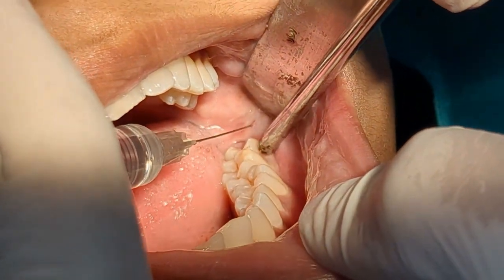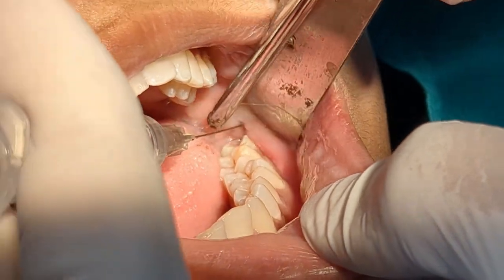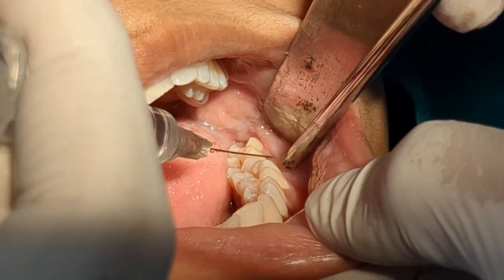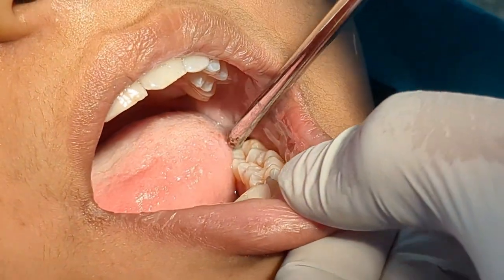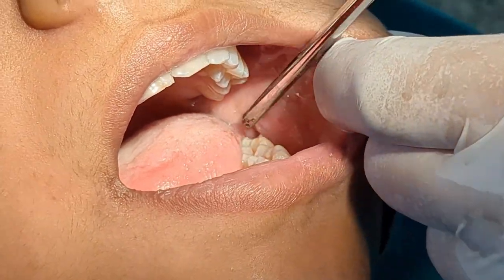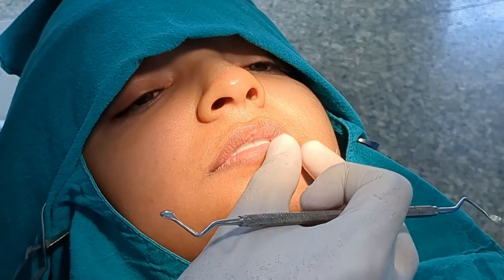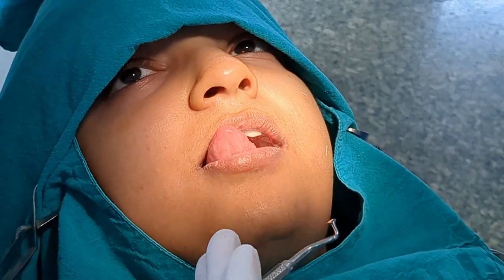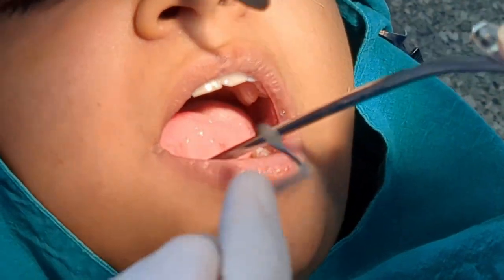This local anesthetic solution is with adrenaline as a vasoconstrictor, so I'm depositing it as an infiltration so that there is less bleeding while giving the incision. Feel numbness? Alright. And what about the tongue — do you feel numbness at the tip of the tongue on the left side? Good.